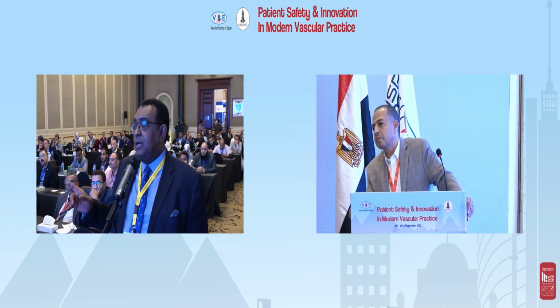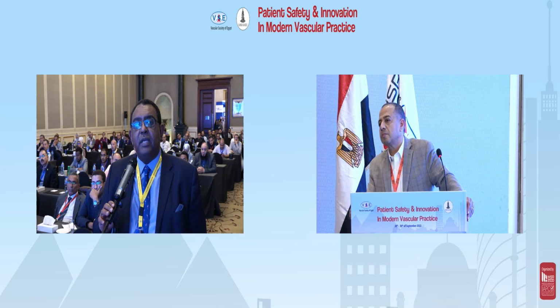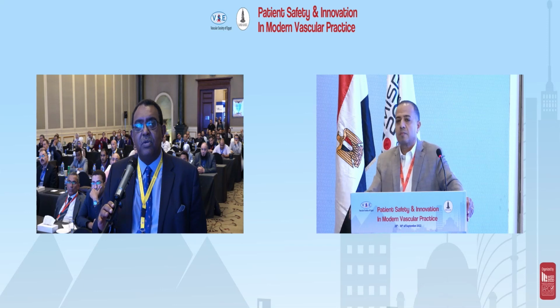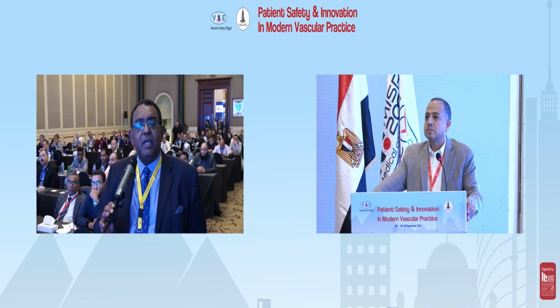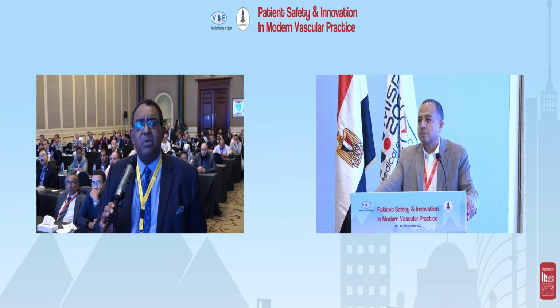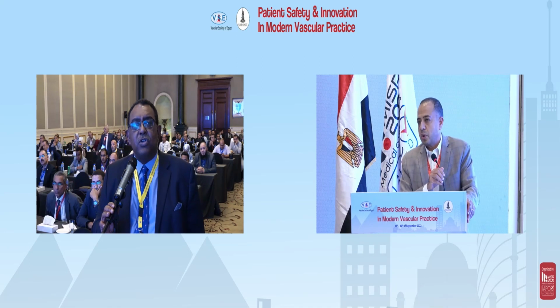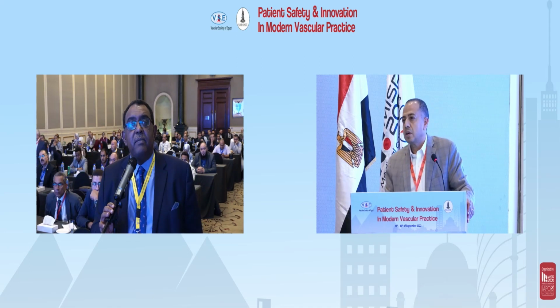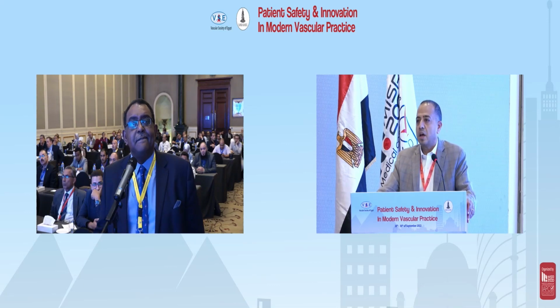I just wanted to come on to Ahmed's question about using IVUS for EVAR. Do you not think CO2 is probably better for an EVAR in a patient who you can't give contrast than IVUS? Because I've seen one done with IVUS at another hospital, and he came back to us with a whopping type 1B endoleak and sac expansion within a year and a half. So I wasn't very impressed. So have you used CO2 angiography for EVAR? Yes. Do you not think that's better than IVUS?